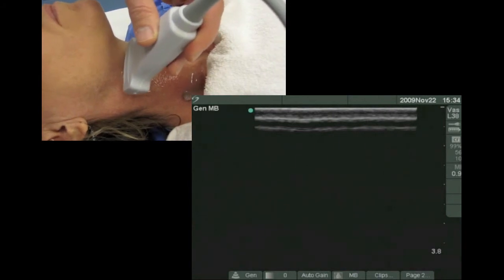The next step I do is I scan the entire target. Before I stick a needle in something, I want to know the trajectory I'm trying to head in. And before I get anything sterile, I want to know if the vessel I'm trying to cannulate is actually a reasonable target or if I should look somewhere else. So here's the next step.